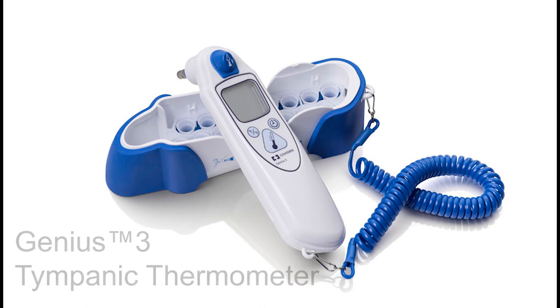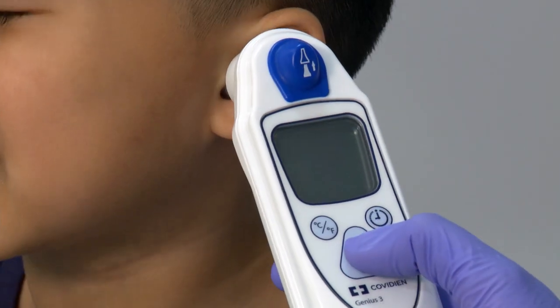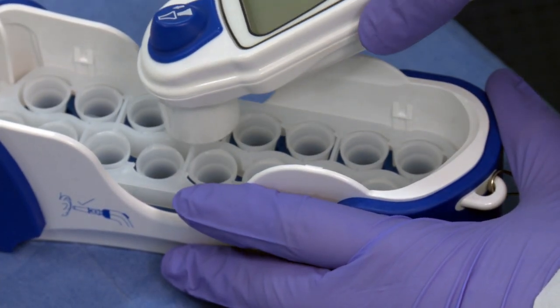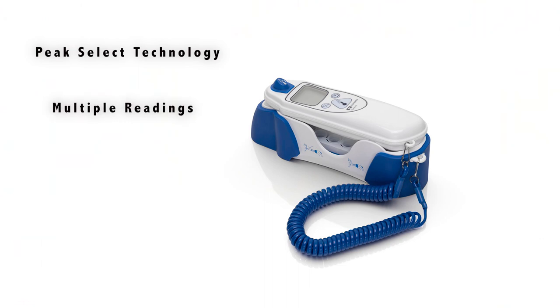Introducing the Genius 3 tympanic thermometer. The Genius 3 delivers an accurate temperature. Disposable no-touch Genius probe cover application and ejection reduce potential cross-contamination. Utilizing our patented Peak Select technology, the Genius 3 takes multiple readings and selects the highest temperature for display in one to two seconds.